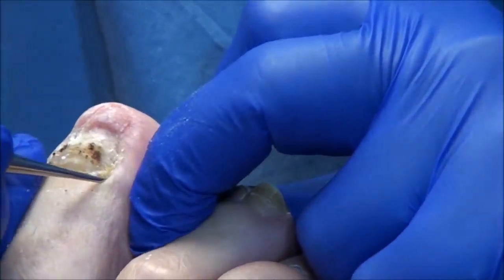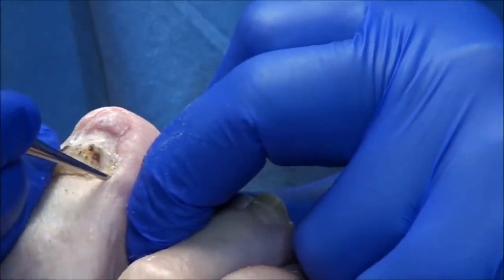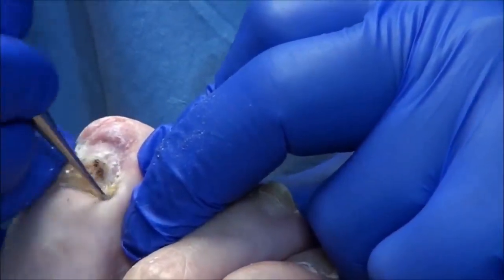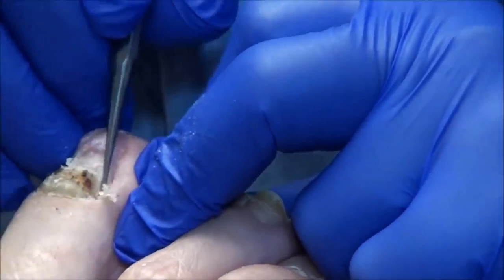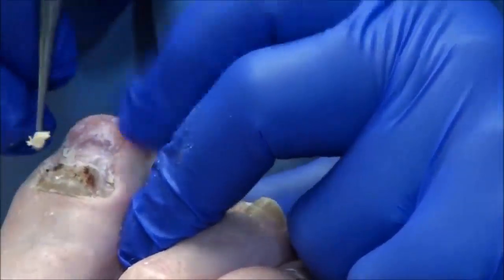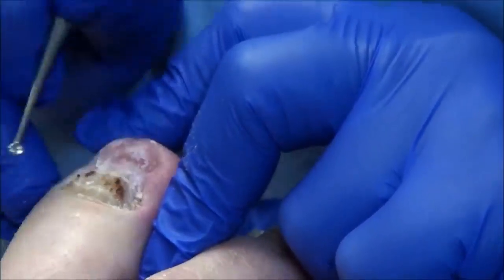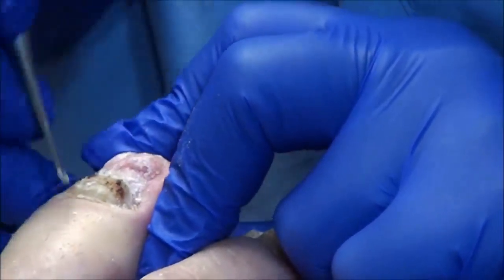Yeah, I mean, you get a lot of crud back under. Yeah. Crud, that's a technical term. You learned that in medical school, right? Goes right along with gunk. Yes, this is just a lot of dead skin and debris and sock fuzz and dirt, and it just kind of gets stuck back there.